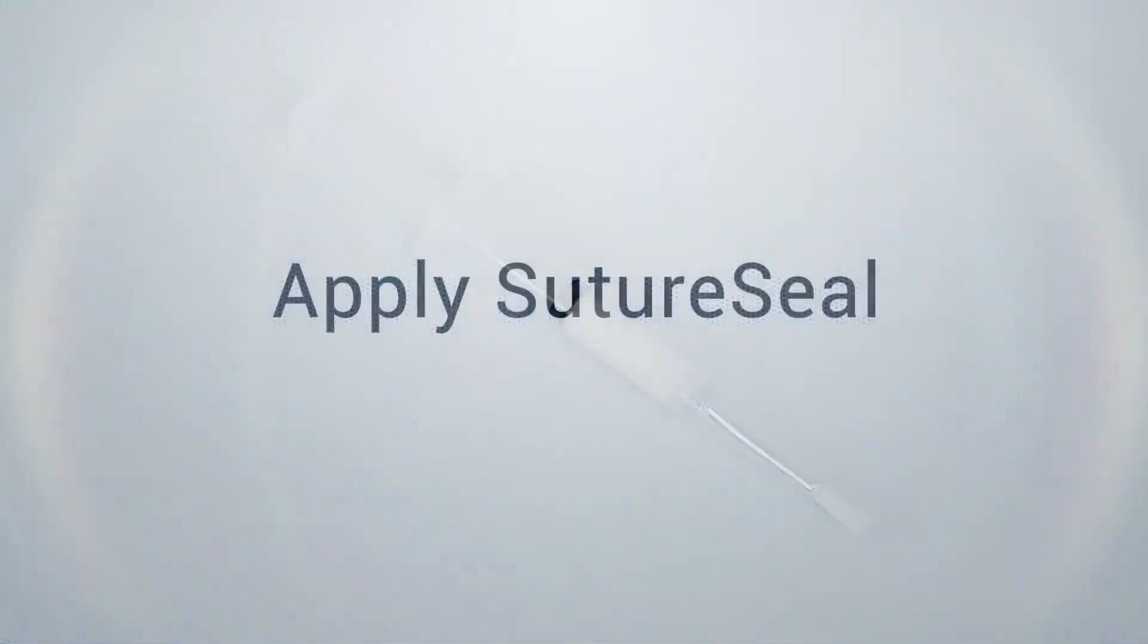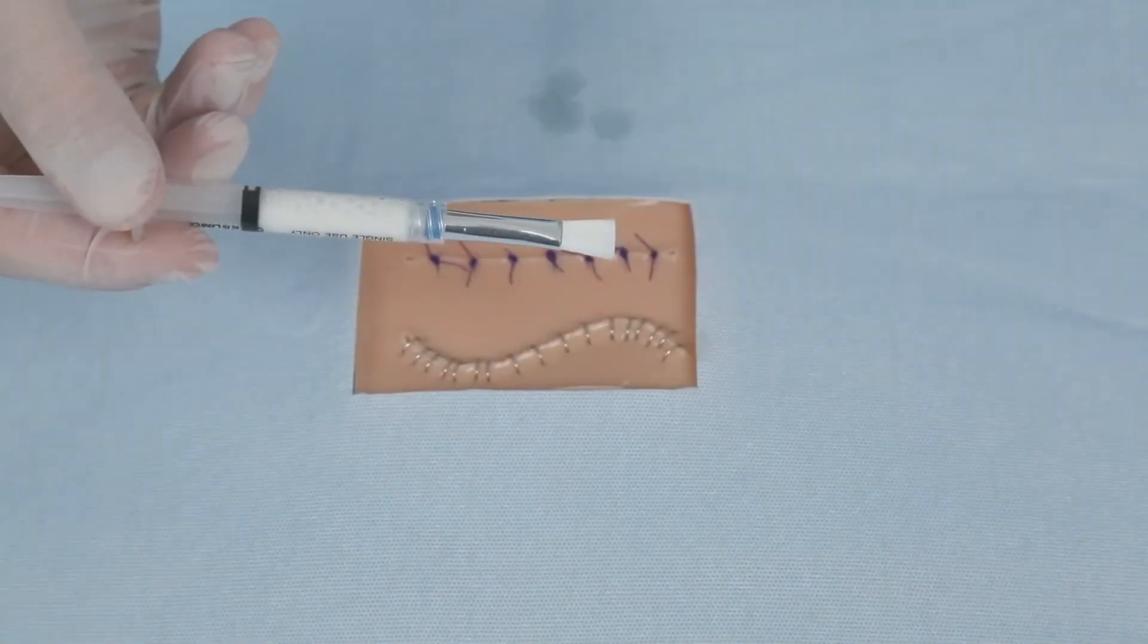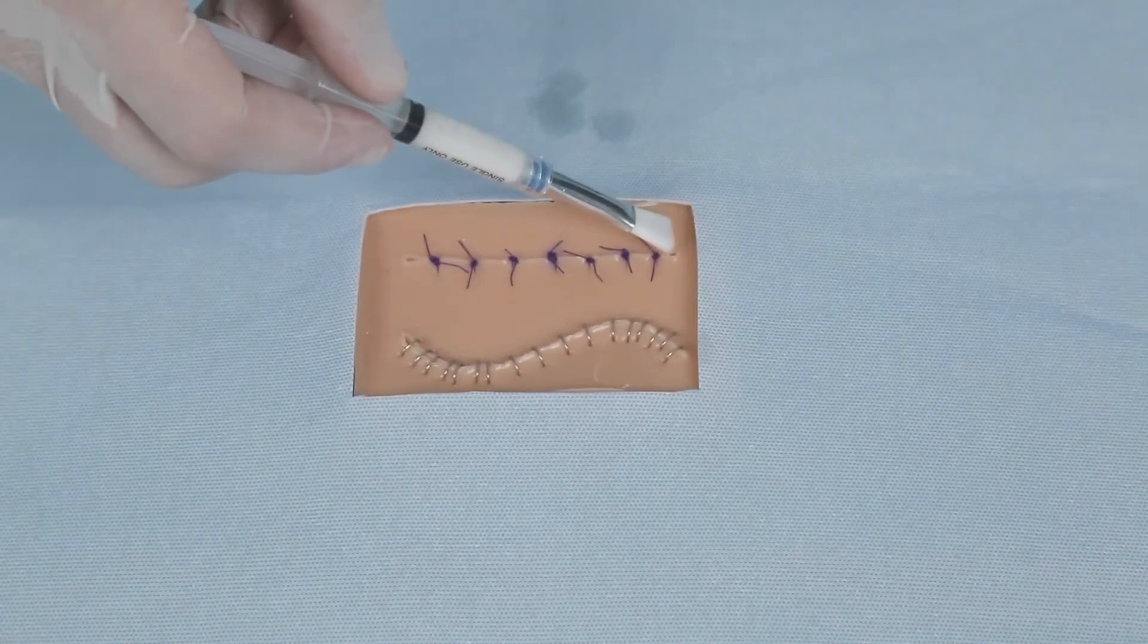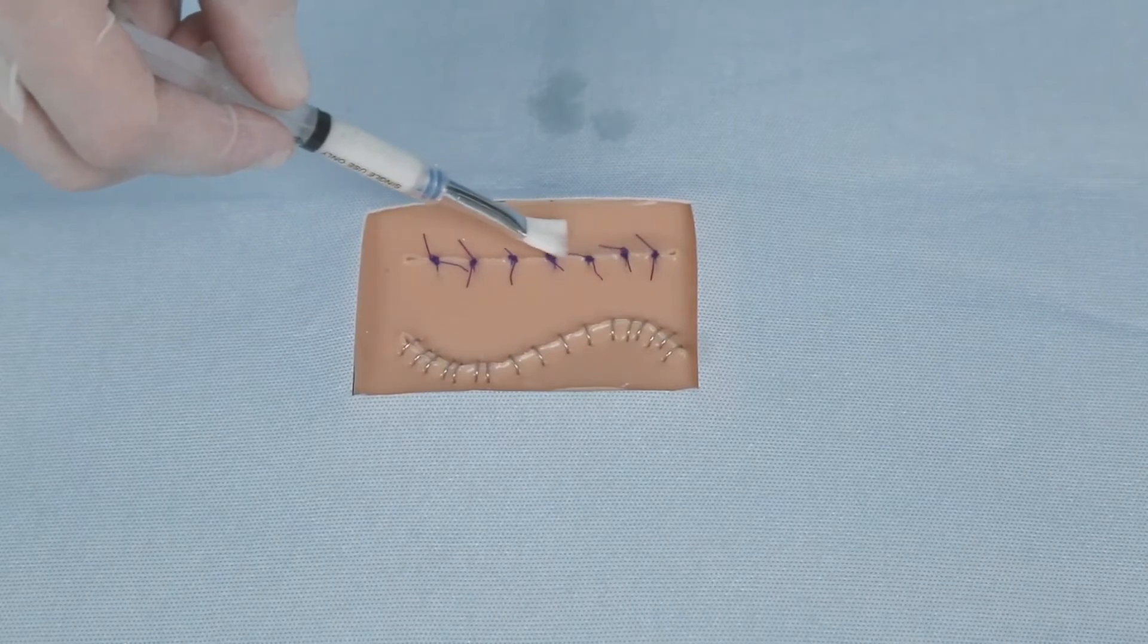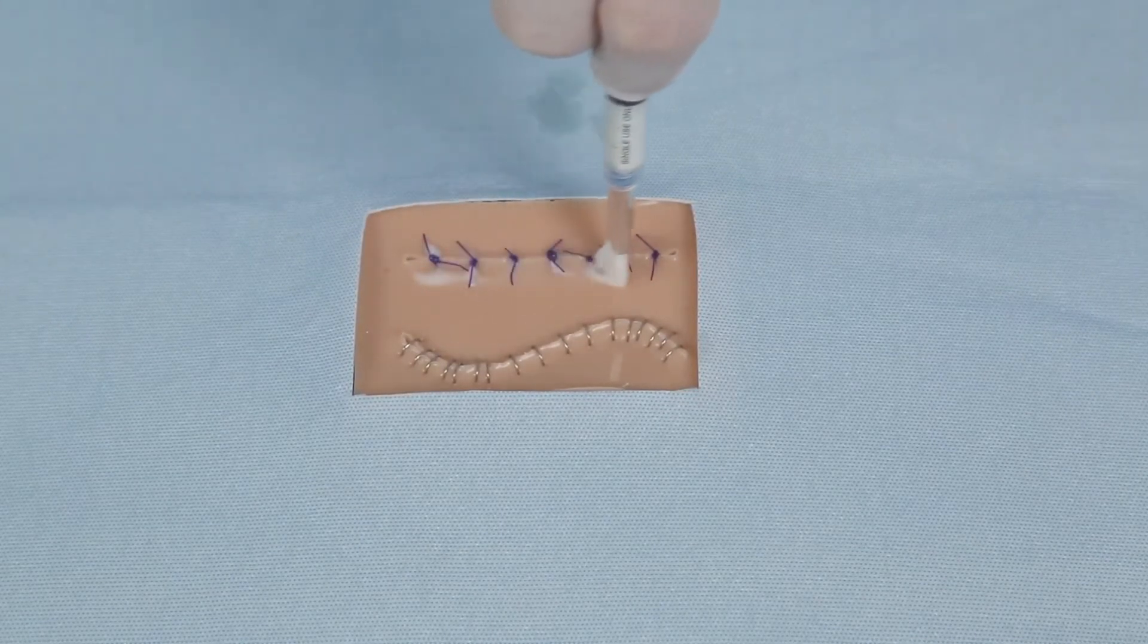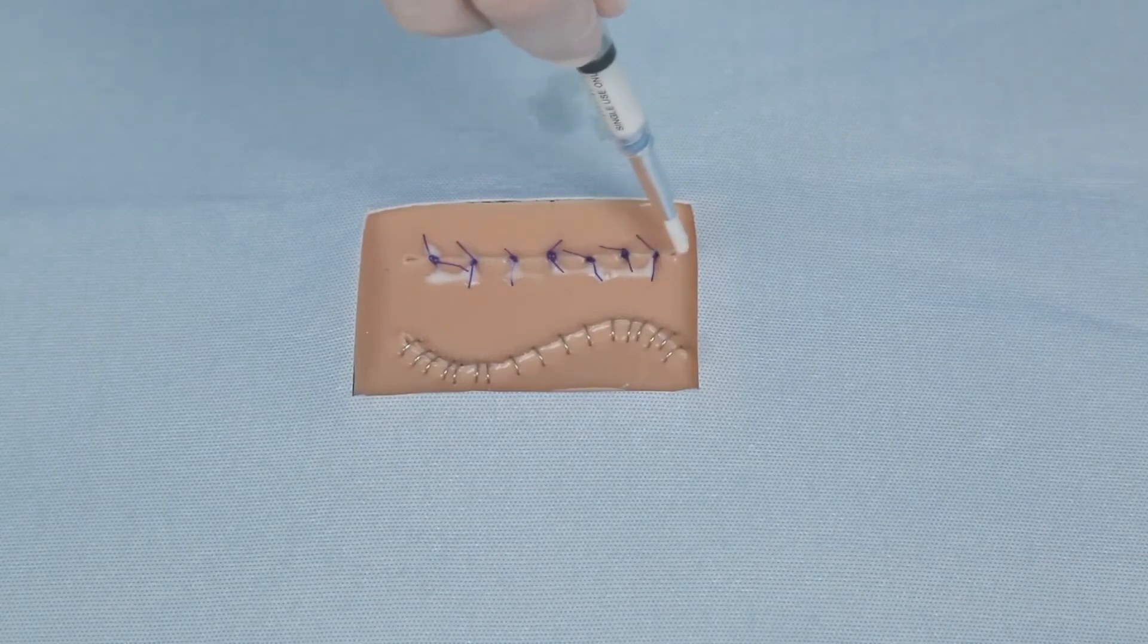The last step is to apply SutureSeal to the affected area. SutureSeal can be applied to incisions with sutures or staples and many types of open wounds. It is important to note that after the products are mixed you have approximately 80 to 120 seconds to apply SutureSeal to the incision or wound before it gels into a clear flexible sealant.